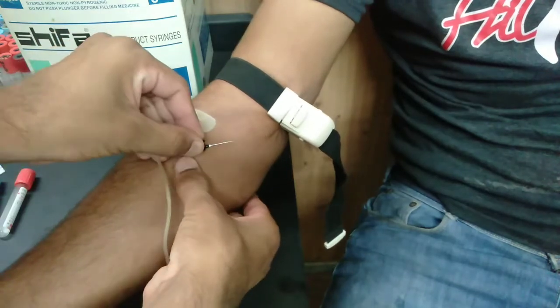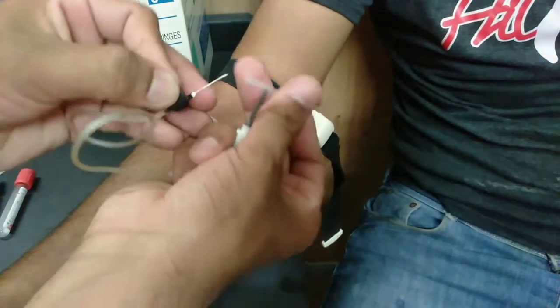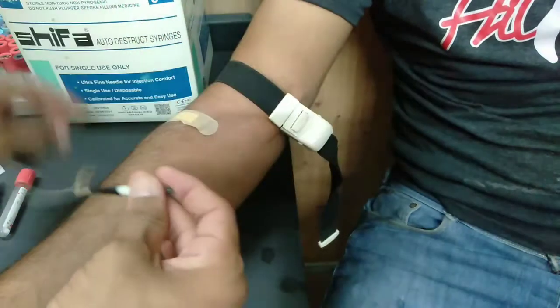When we insert it into the vessel, we will secure it with tape. If we open its cap, then we can proceed. We can open it to allow blood flow.